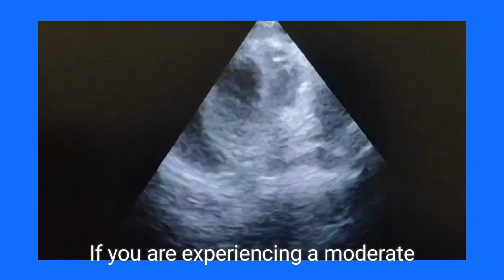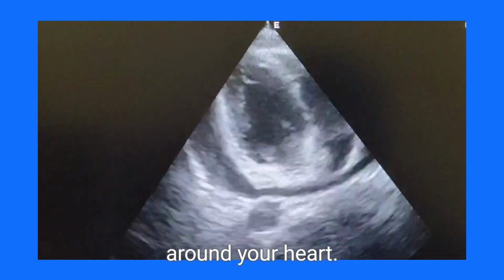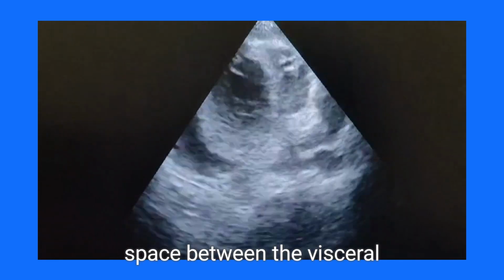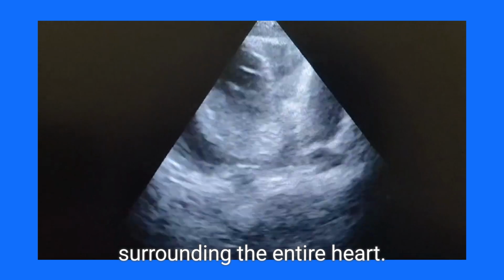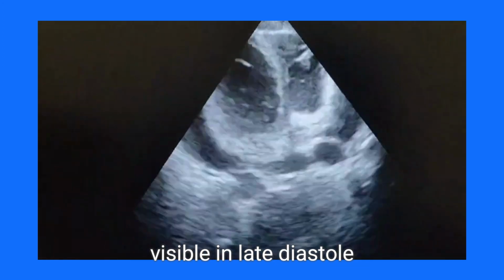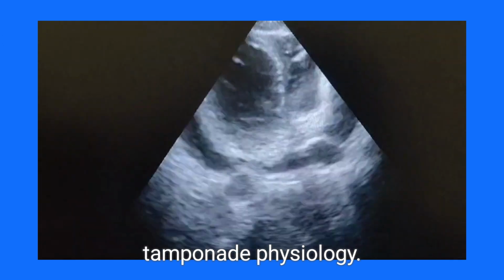If you are experiencing a moderate pericardial effusion, you may notice fluid accumulating around your heart. It will appear as an anechoic, or fluid-filled, space between the visceral and parietal pericardium surrounding the entire heart. In this condition, you may experience chamber compression, with right atrial collapse, visible in late diastole, and right ventricular collapse, crucial for diagnosing tamponade physiology.